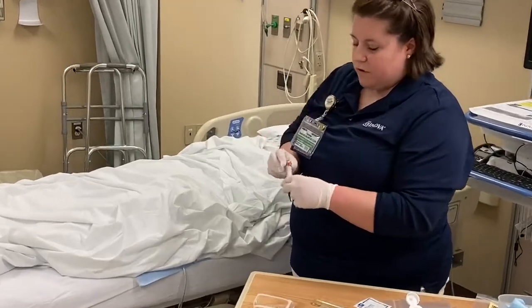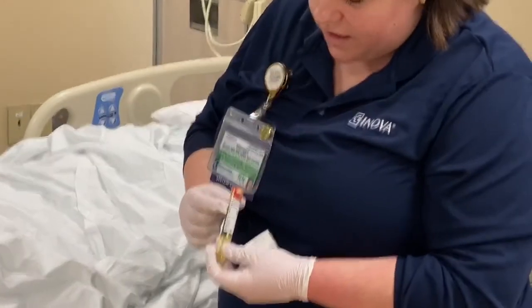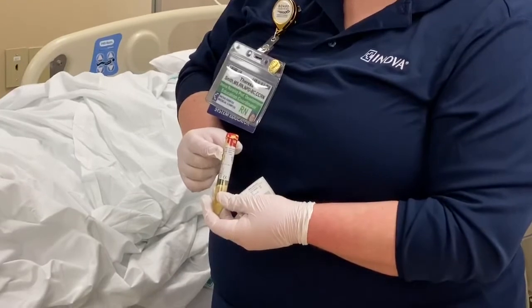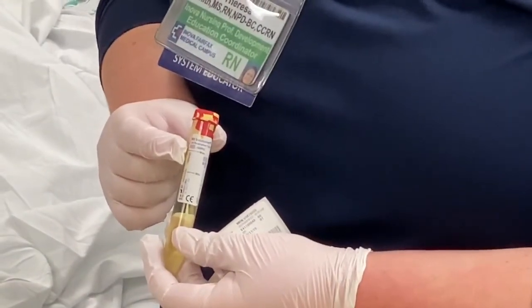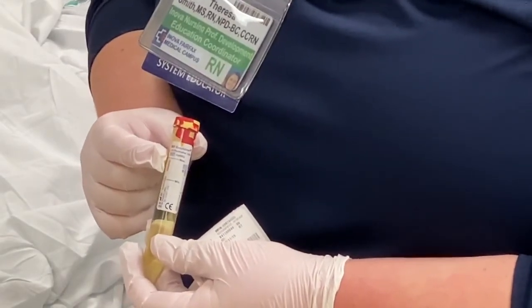Now this tube also has a specification for how you label it. If you look right here, you can see that there's a max line on the tube. The lab wants to make sure that they can see the max line. So when you put this label on, you need to put it just below the max line of the tube.